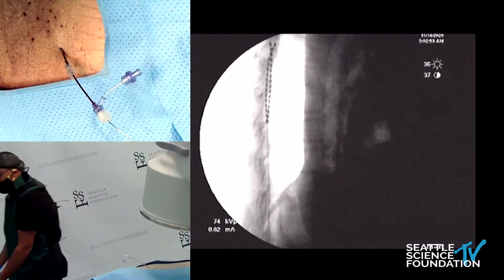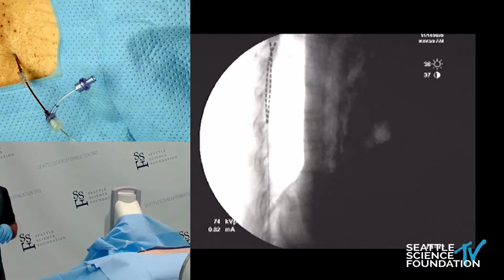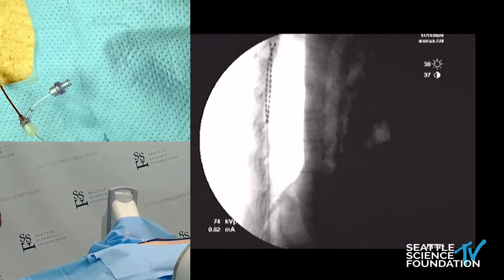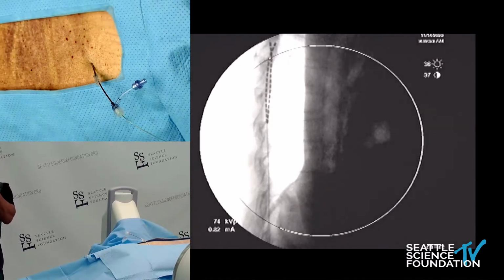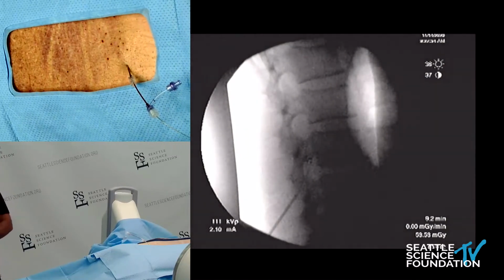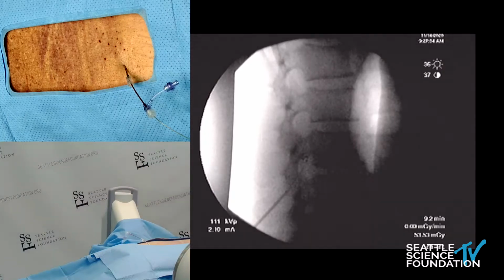So this is a good time for you to just take a break, take a big, deep breath, really ensure that your lead is right where you want. Also make sure your mask doesn't fall off your face. With all the apparatus on my head, it's pulling down everything. So I'm going to grab some new gloves here, Tyler, if you don't mind. Thank you, sir. All right, beautiful.